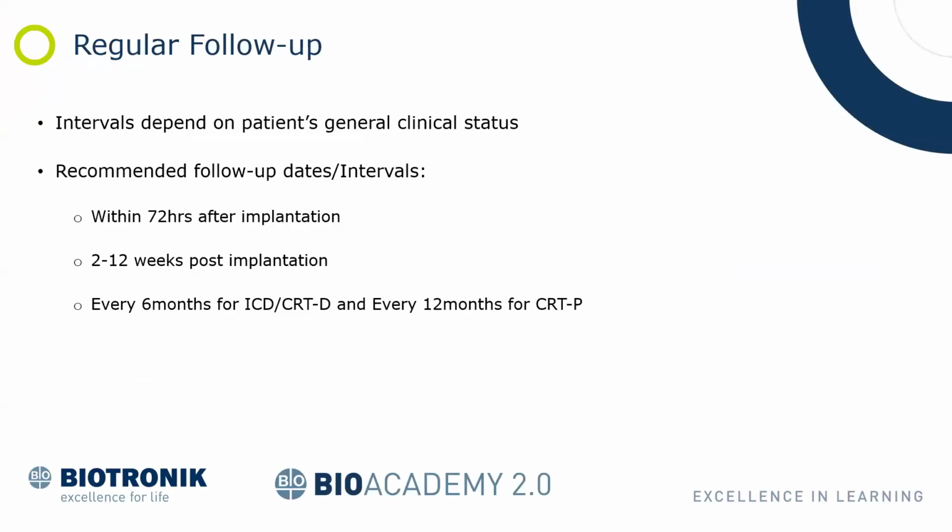Regular follow-up intervals depend on the patient's general clinical status, as per the doctor's recommendation. But the recommended follow-up intervals are within 72 hours after implantation, 2 to 12 weeks post-implantation, and every 6 months for ICDs and CRTDs, and every 12 months for CRTPs and pacemakers in general.